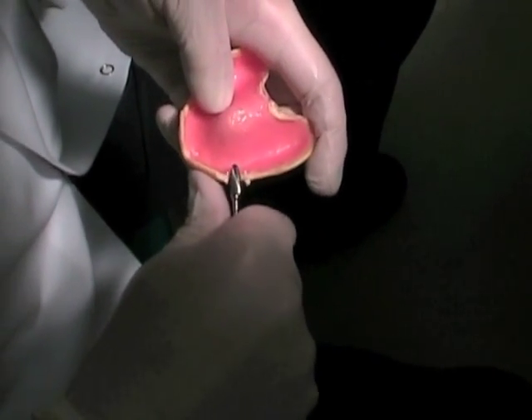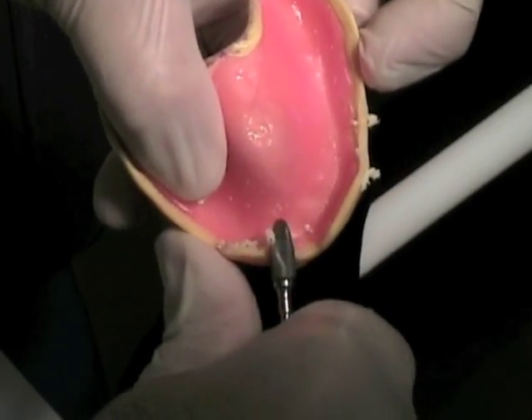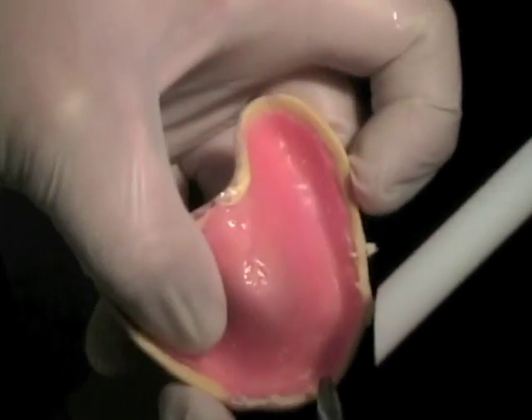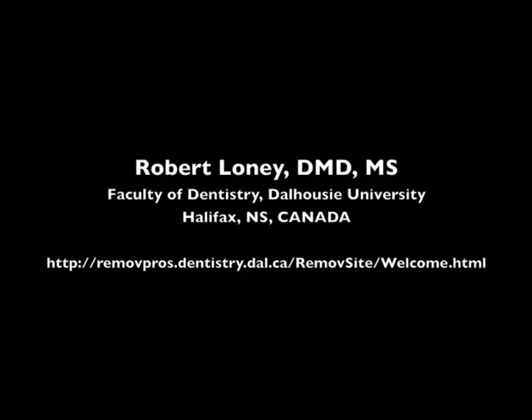Trim your tray flanges and the posterior border of the tray so they are properly extended. Then smooth and round the edges. The tray is now ready for border molding.